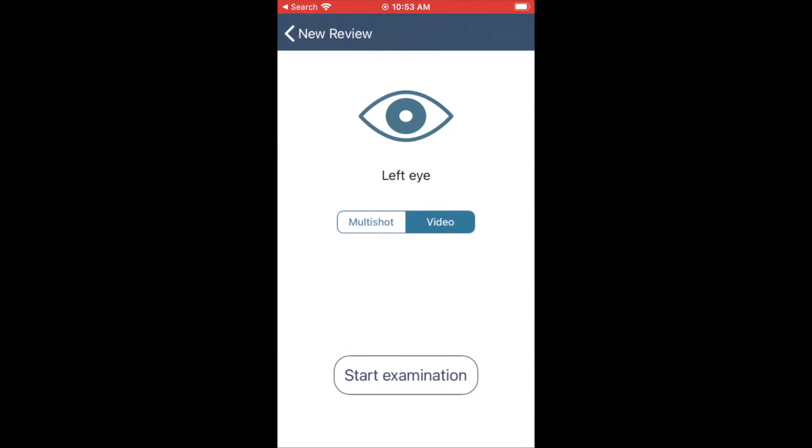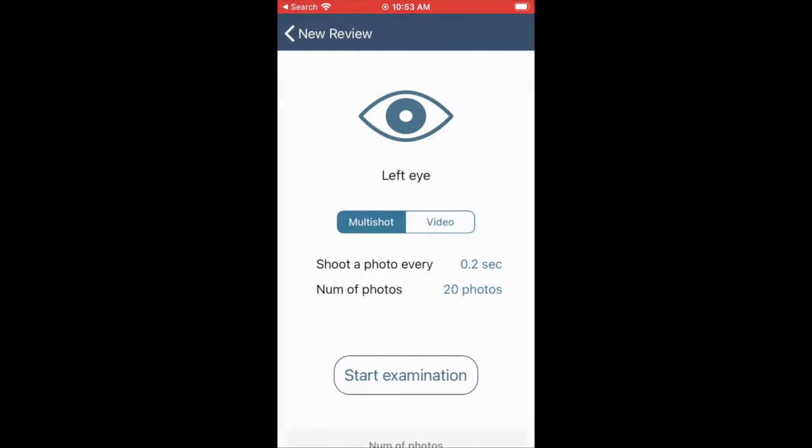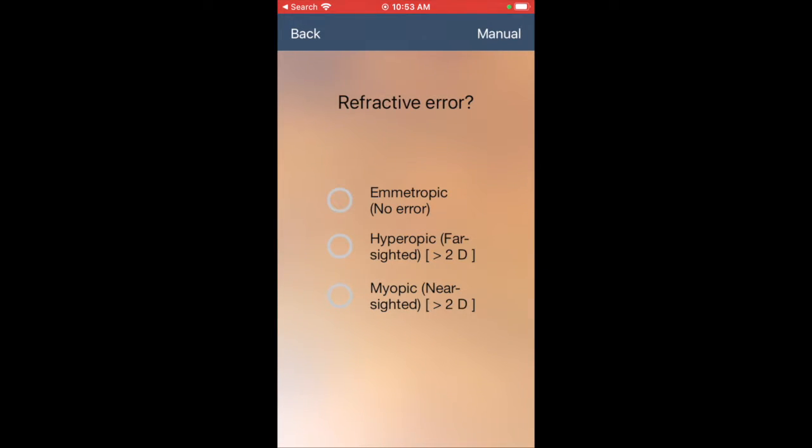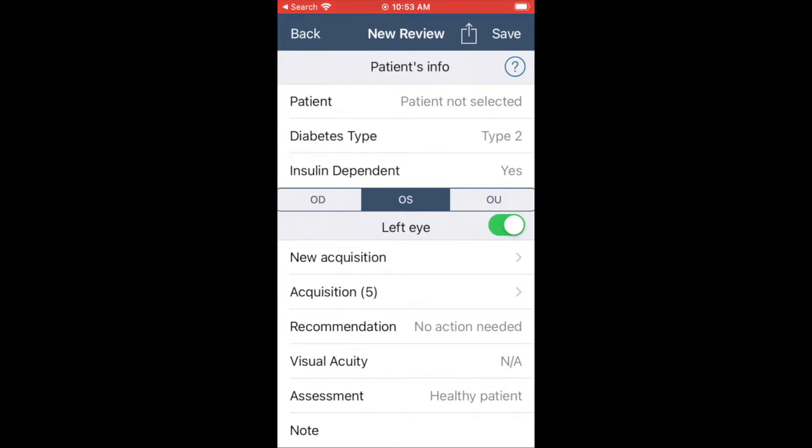For our demo, we're going to use multi-shot, which takes multiple photos, and we're going to take 5 just for the video. And you can change the settings. Then you're going to choose whether they have a dilated eye, and then you're going to choose a refractive error, which you should already know. And then we'll take an image, and it'll take about 5.